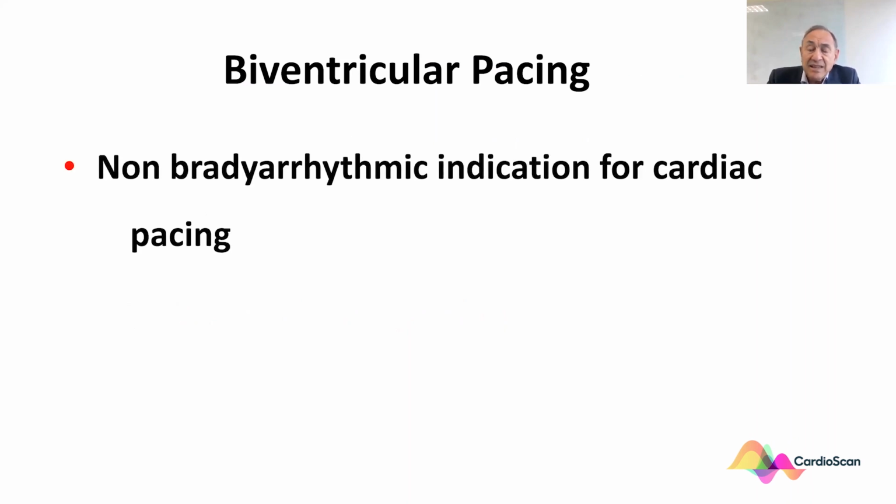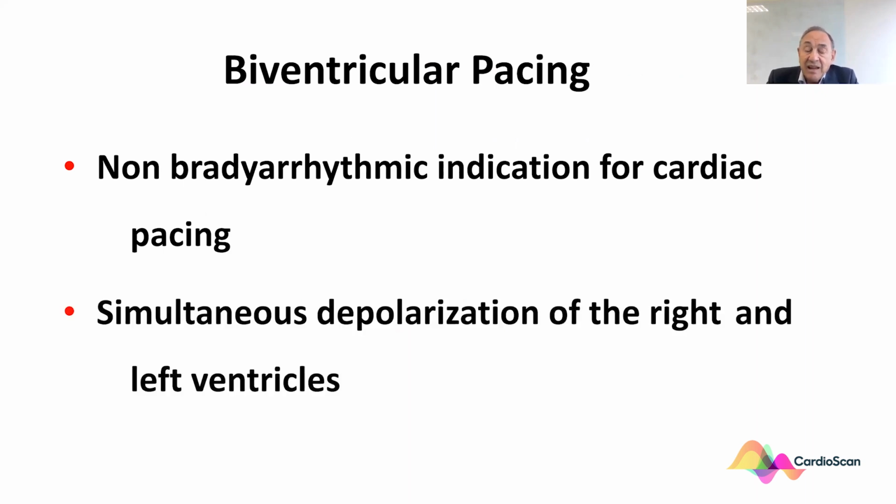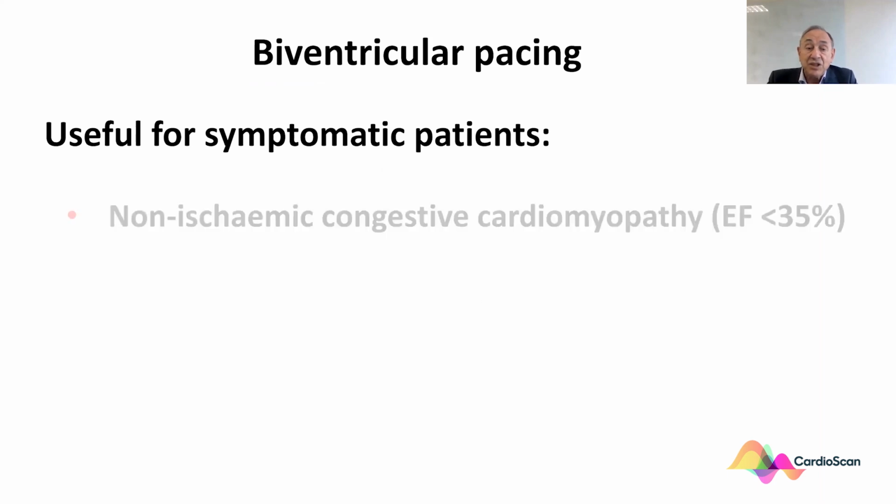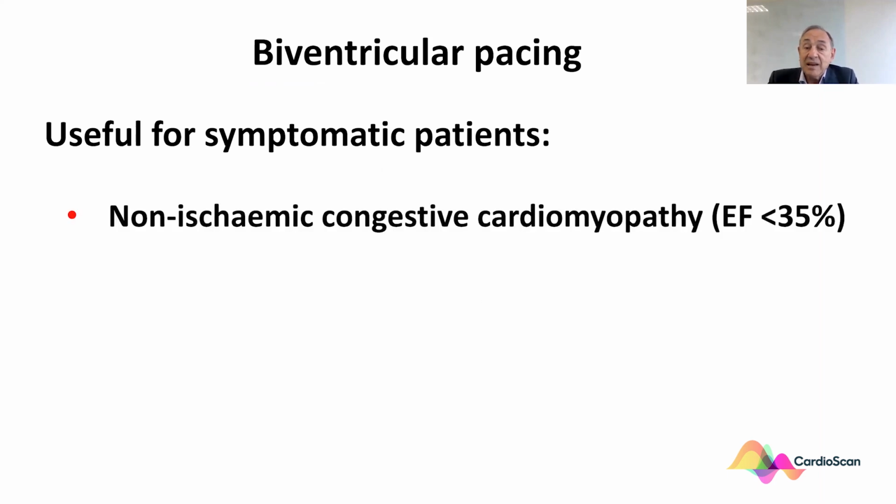Biventricular pacing is used and indicated for non-bradyarrhythmic, it's the only non-bradyarrhythmic indication for cardiac pacing, and involves simultaneous depolarization of the right and left ventricles. It's useful for symptomatic patients with non-ischemic congestive cardiomyopathy with an ejection fraction of less than 35%.